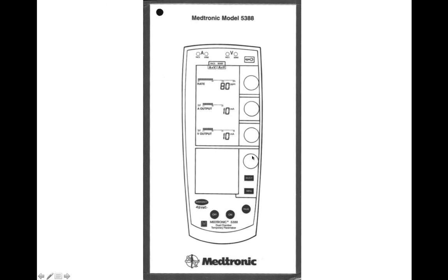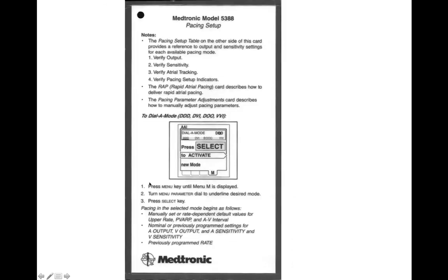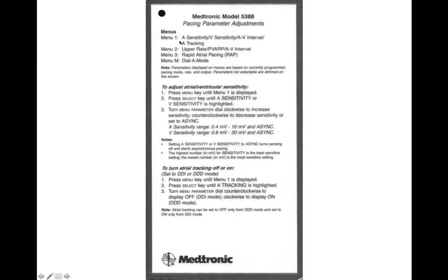You would rotate your knob here and see that menu displayed right here, and use your selections with this tab. This is also where you would find your atrial output sensitivities and your ventricular output sensitivities, as indicated in your instructions. This also goes through adjustment of your atrial and ventricular sensitivity.